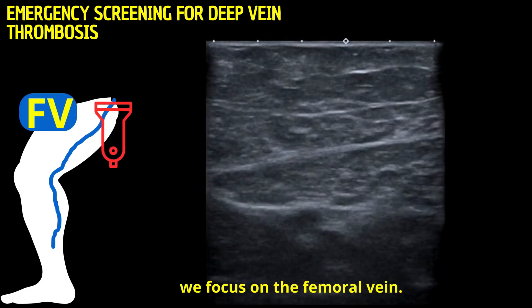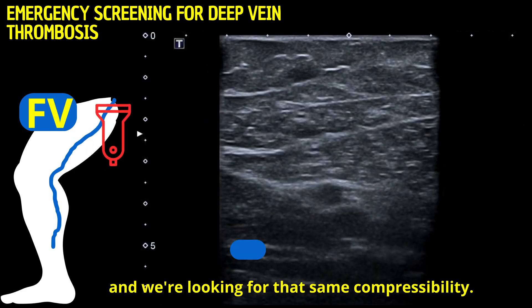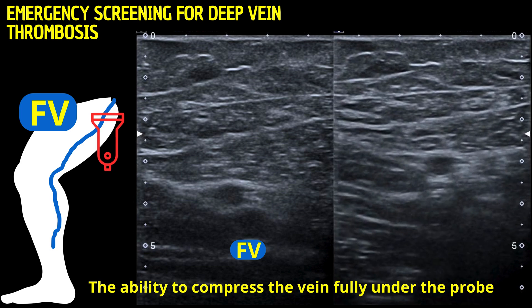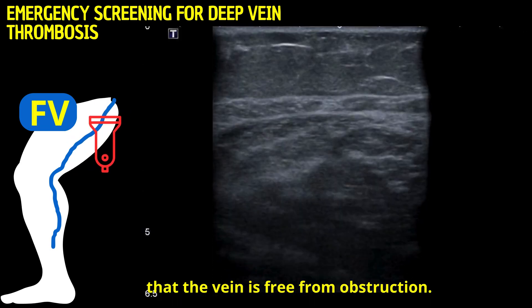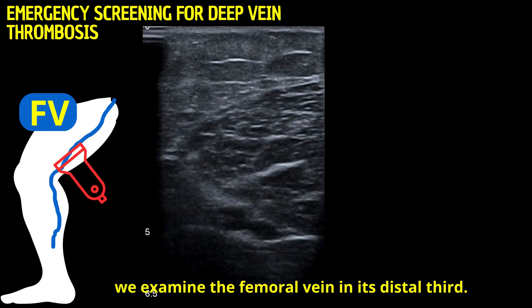Moving slightly down, we focus on the femoral vein. Again, we apply pressure, and we're looking for that same compressibility. The ability to compress the vein fully under the probe is a good indication that the vein is free from obstruction. We examine the femoral vein in its distal third.